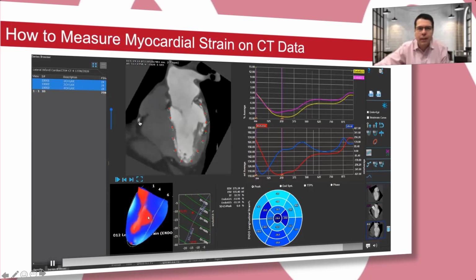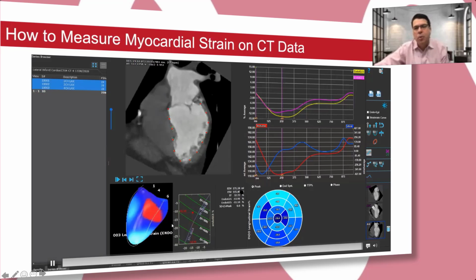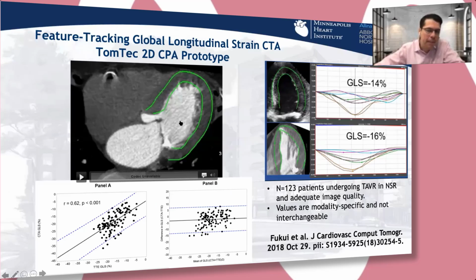You can see a stent in the RCA, and there was another stent in the circumflex, and multi-vessel infarct. Not only depressed ejection fraction, but also depressed strain. And that's the importance of that. Now, the validation of this software came from 2 groups, with one in Leiden, Dr. Bax's group, showing that the strain and EF are very closely correlated, as you would expect, but the strain by CT and strain by echo also had a very good correlation to show that this could be a potential substitute for strain by echo.